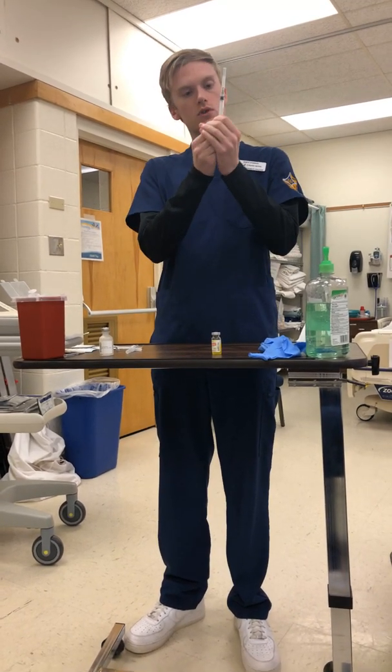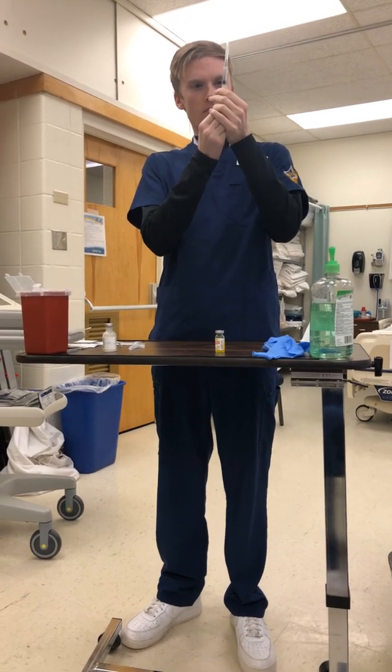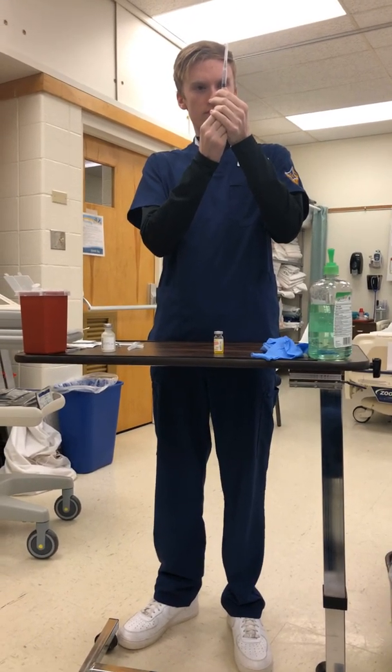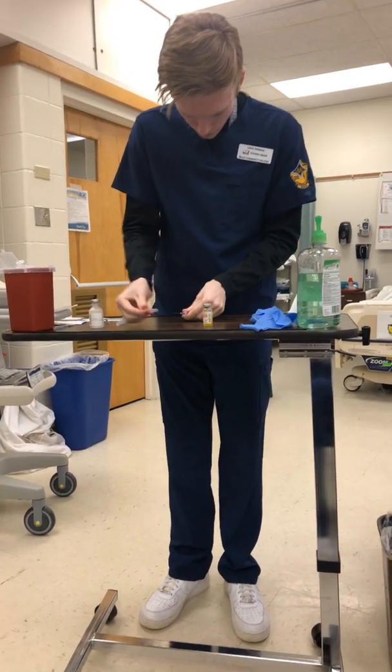I'm going to be drawing up 2 mils. There we go. And we already cleaned up the top.